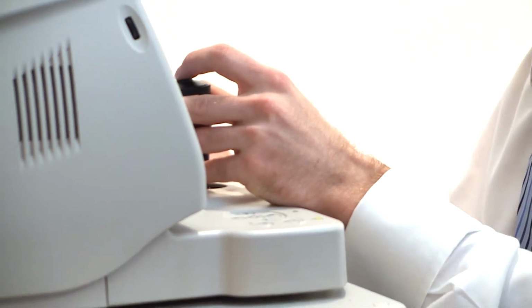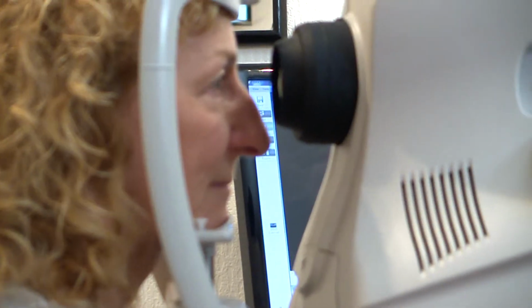One quick blink, and very still now, try not to blink, keep still.